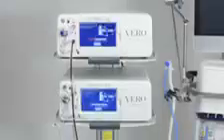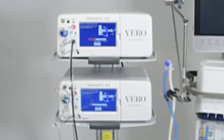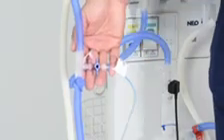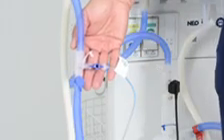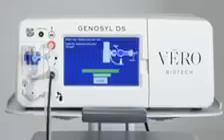A sample line leak test will automatically appear on both consoles. Follow the on-screen prompts for completing the water trap sample line leak test. First, close the blue stopcock located on the end of the blue sample line. Once the test is complete, reopen the stopcock to the same position as pictured on the screen and press Accept.